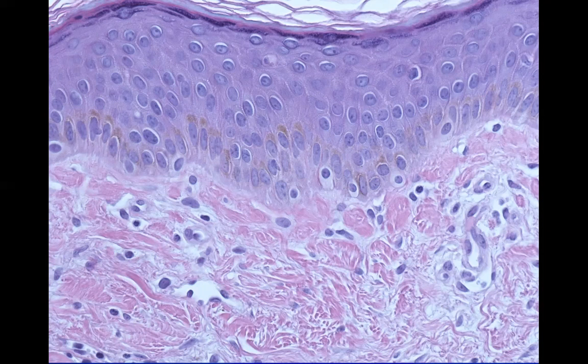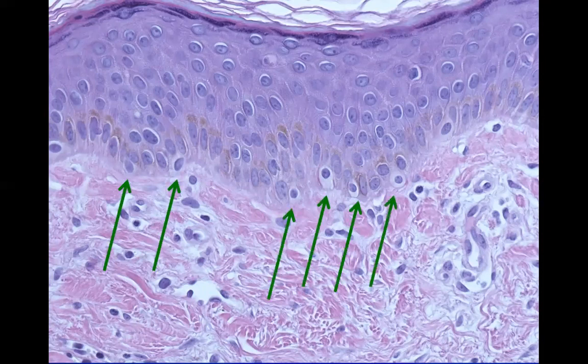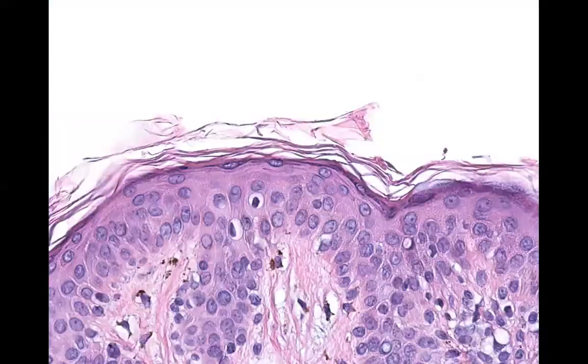And then in our darker areas, for example, our axilla, our groin, kind of these nether regions, you have more melanocytes as well. So just to point out, all the little melanocytes, you see their cytoplasm is different, their shape is different than the basal layer of the keratinocyte. So this is what our melanocytes look like.